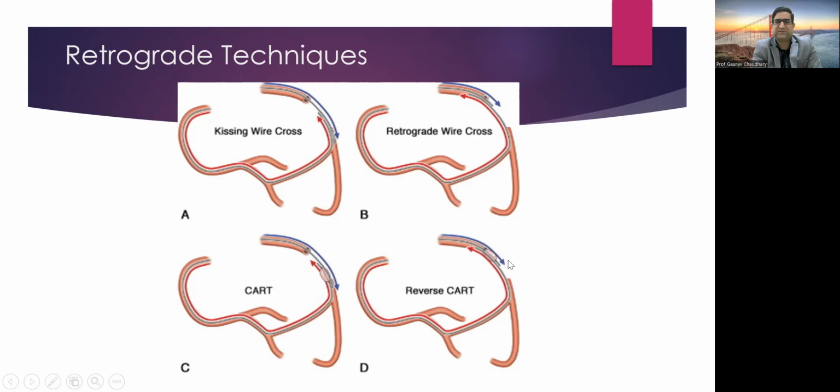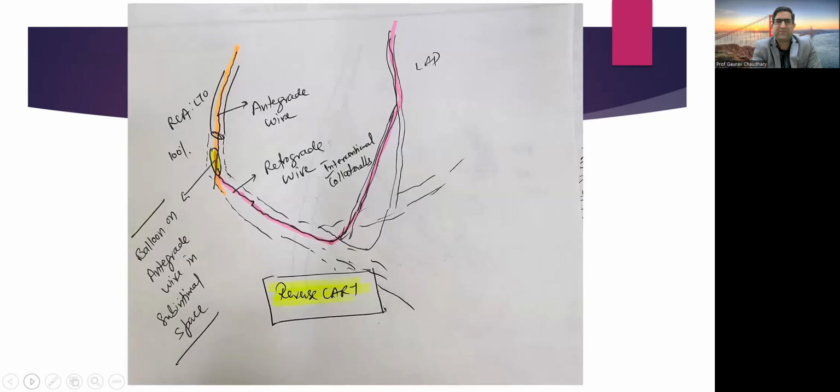Over this, we can then push the microcatheter after anchoring the wire into the antegrade guide, and over that we can externalize with the RG3 or R350 wire. This is the diagrammatic expression of the technique. We can see this particular case is an RCA CTO, and we can take the wire over this antegrade guide.